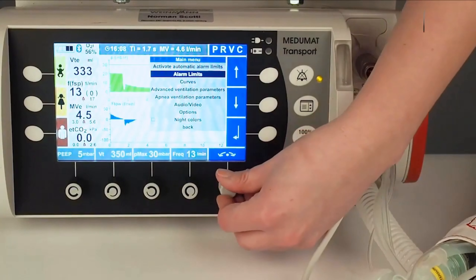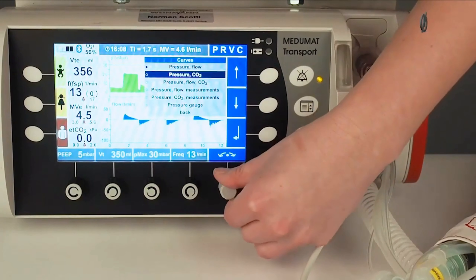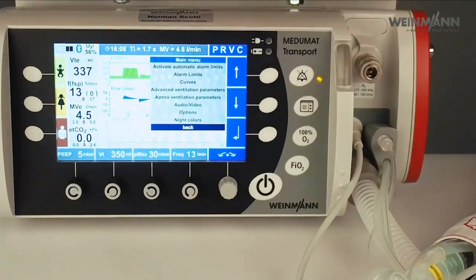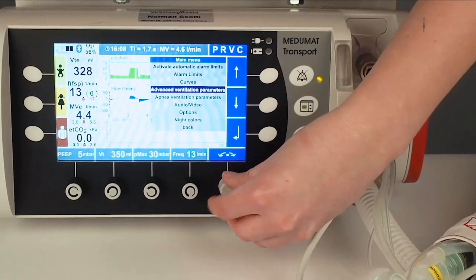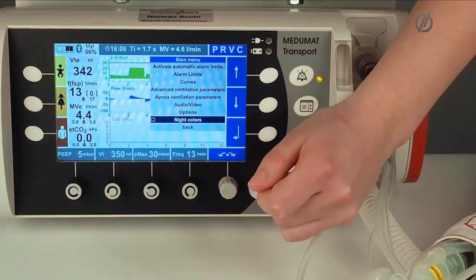In the main menu there is also a curves menu where I can change the displayed curves. Depending on whether CO2 is available in the device, I can switch between curves — obviously no CO2 curve here. I can also do more specific or advanced ventilation settings, and some device settings such as switching to night colors.